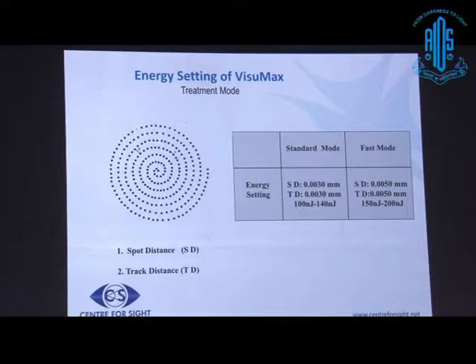Now the femtosecond laser delivers energy to create OBL. You have to titrate the amount of energy that you need. If you use more energy than required, you risk having more inflammation, and using less energy makes the dissection much more difficult. With the higher frequency next generation femtosecond lasers, the energy requirement is less, because these higher frequency systems deliver energy in smaller durations of time. Also, the higher numerical aperture allows you to focus the spots more precisely, and therefore you're able to get more optimal results using less energy.